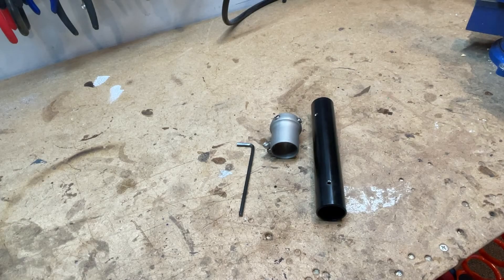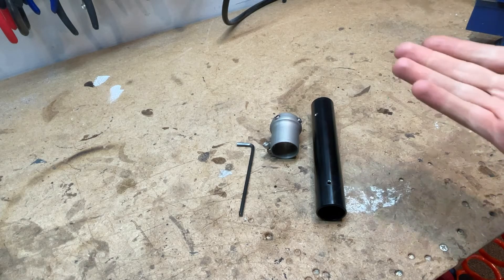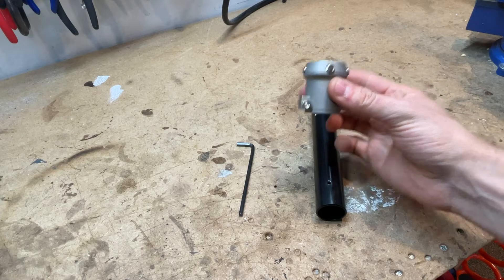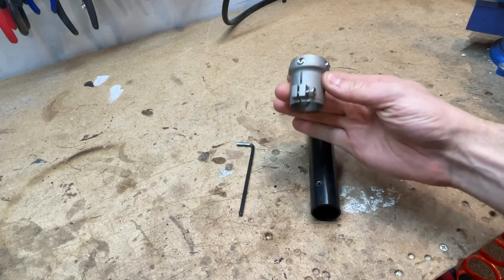Hi everyone, welcome to the 3D Pets resource page. Today I'm going to be showing you how to attach your leg to a stage one mount. Obviously we don't have the jacket here — this is just a demonstration — but this is what will be coming off of the jacket when you receive it, if you have the stage one mount.